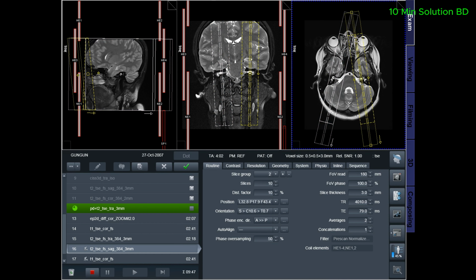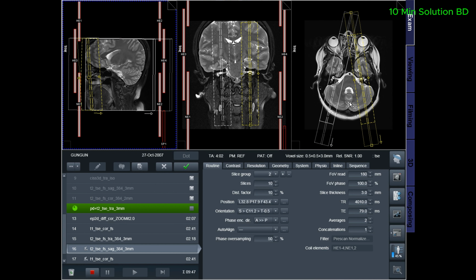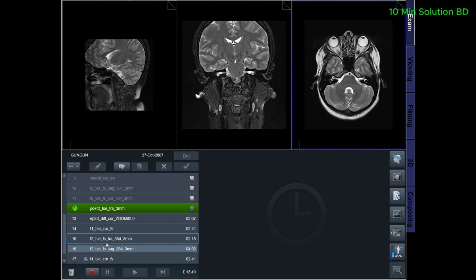hairpins. If possible, provide a chaperone for claustrophobic patients, for example, a relative or staff. Contrast injection risks and benefits must be explained to the patient before the scan. Gadolinium should only be given to the patient if GFR is greater than 30.